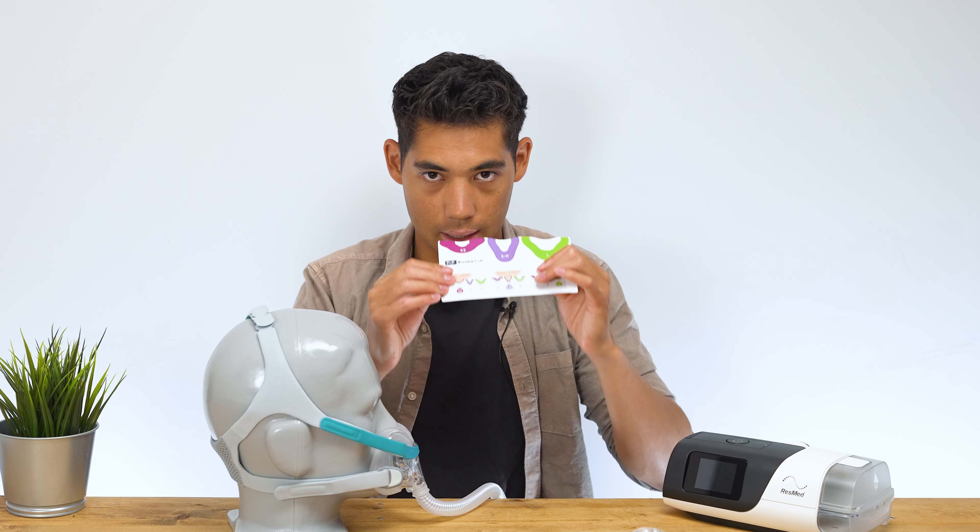At the front of the mask the tube goes straight down, which adds to a more low-profile design. However, there's no elbow that swivels and turns — this portion doesn't swivel. It's an oval shape and once it clicks in it's solid. It's a little unfortunate that it doesn't have a swiveling elbow, but that's how they went. It's a little more low profile, so you give and take a little bit there.